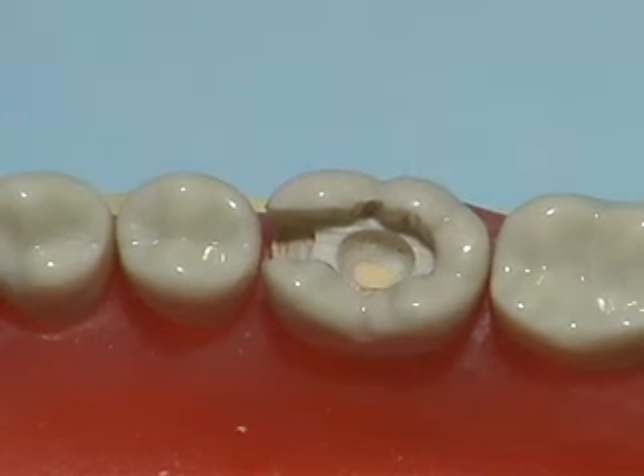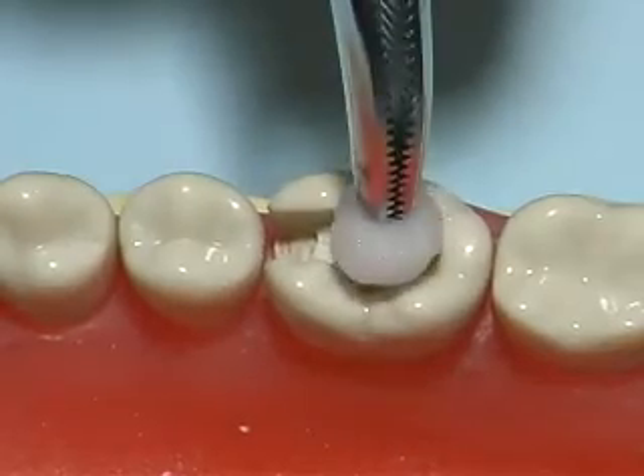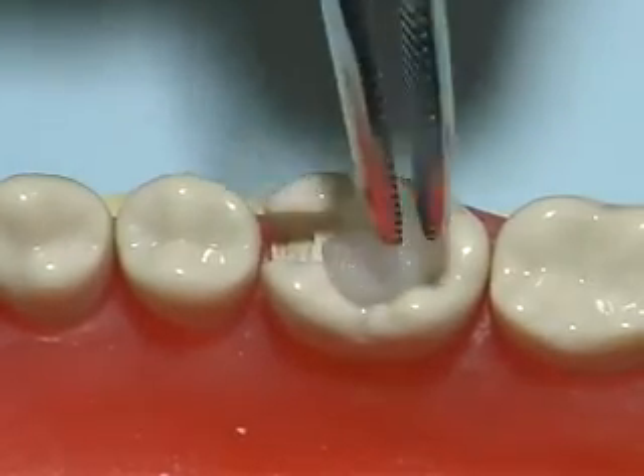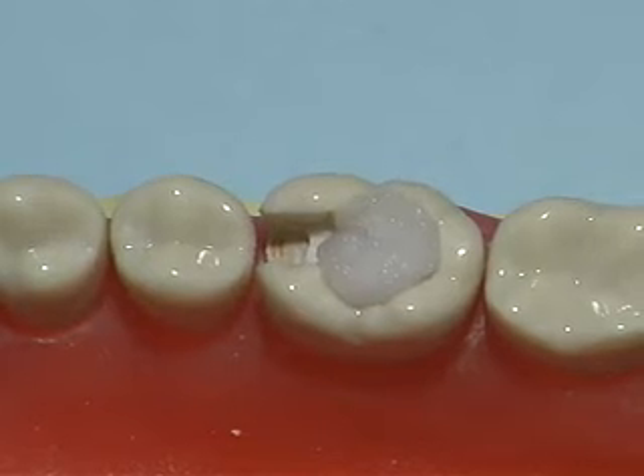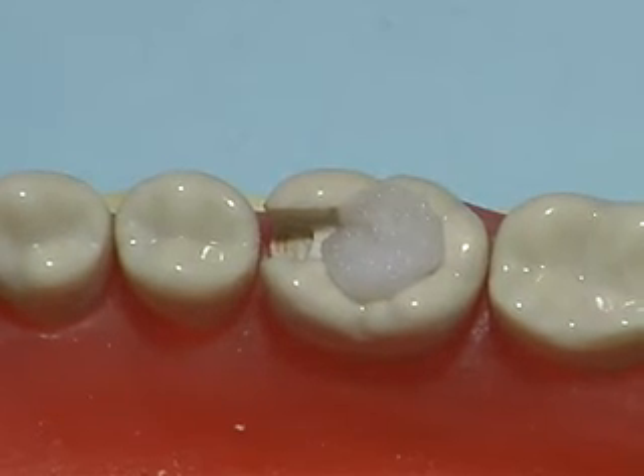Proper setting requires humidity. Place a moist cotton pellet at the opening of the cavity on top of the newly placed cement for 30 seconds. Be sure that the cotton does not contact the cement.